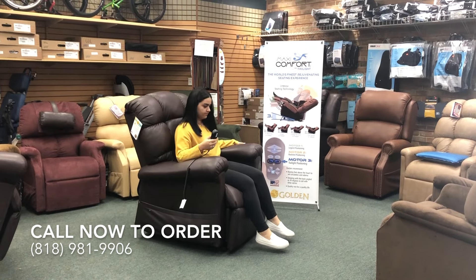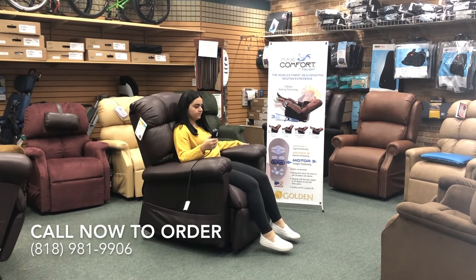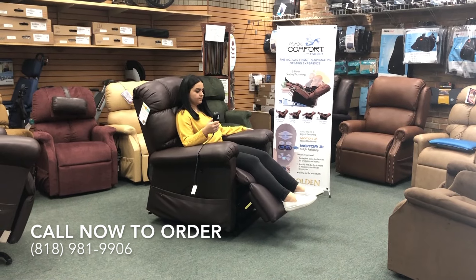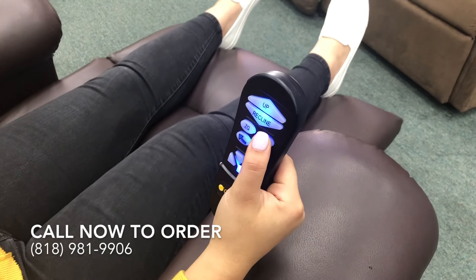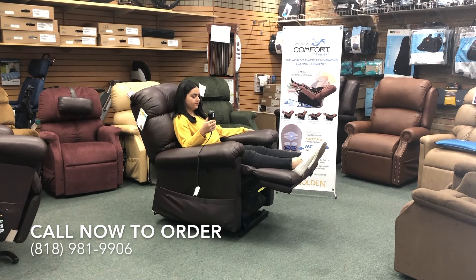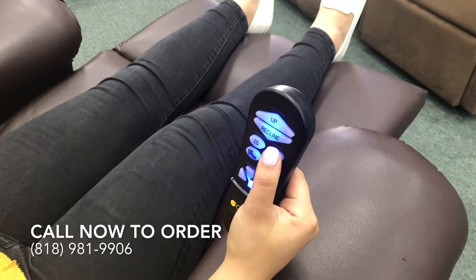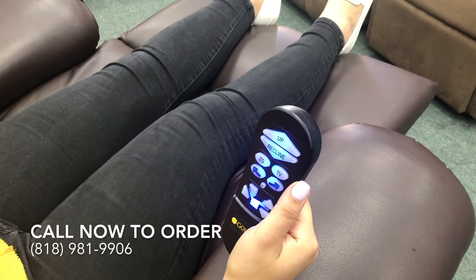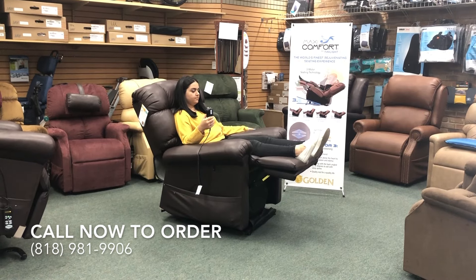We will start this demonstration by putting the chair into the pre-set TV position. Most recliners will stop here with the leg elevation, but Golden takes their chairs to the next level with zero gravity. As you can see here, the seat elevates, bending the knee slightly and relieving the pressure from the back and putting it onto the thighs.